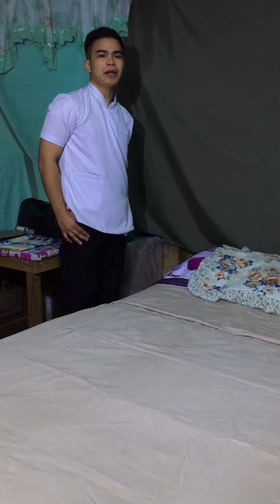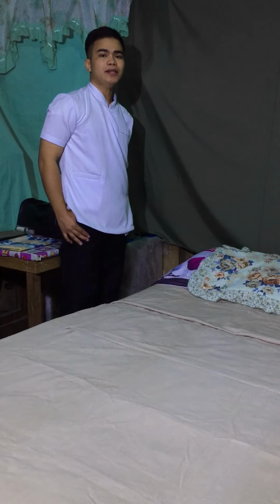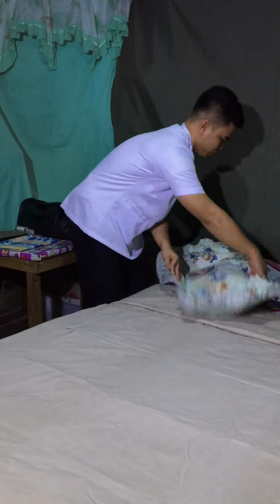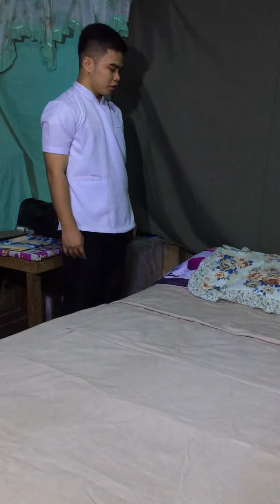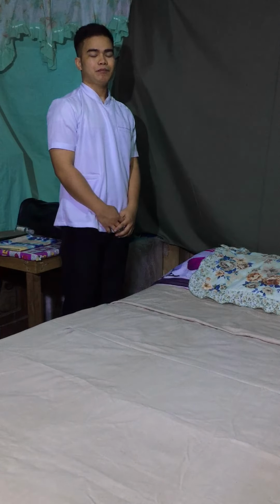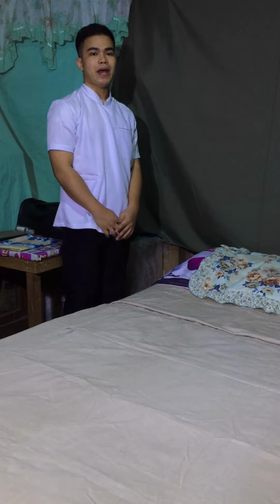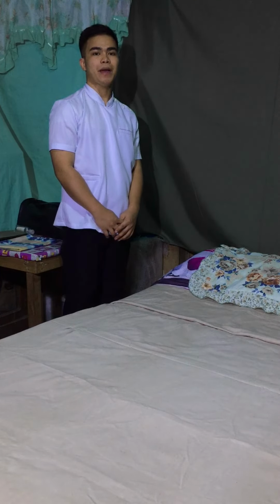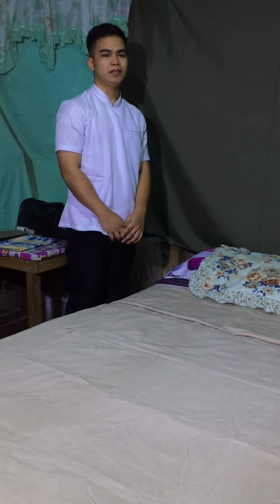Place the pillows appropriately at the top of the bed. This is to provide comfort for the patient. So this is now the closed bed. Place the pillow on the bed with the open end facing the wall, or place the pillow on the bedside table. This preserves the bed when the patient is out of the room for an extended period or when a new patient is expected.